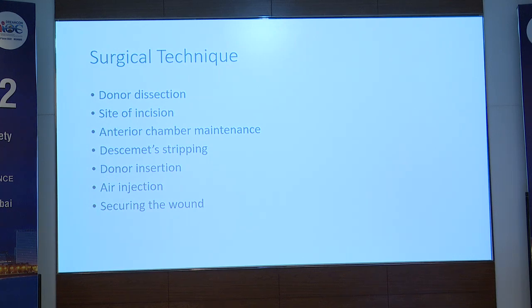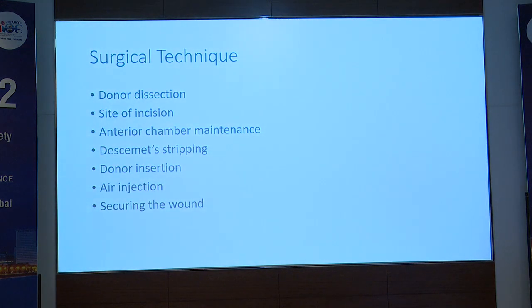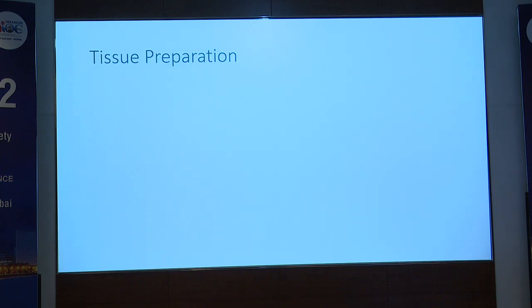So the surgical technique is quite simple. The first step is to prepare your donor tissue. Second is to decide how you would do your surgery in terms of site of incision, your anterior chamber maintenance, Descemet stripping, donor insertion, air management, and securing the wounds.